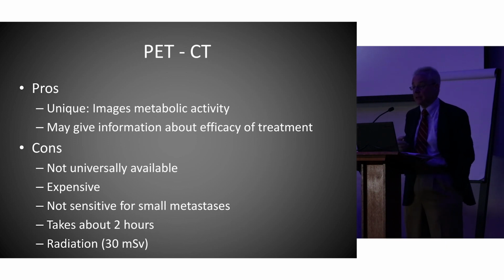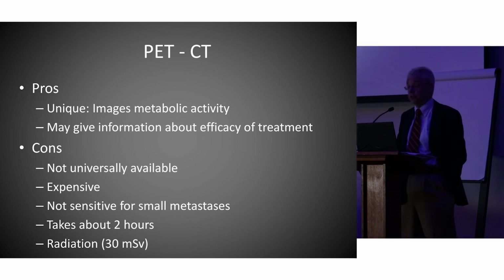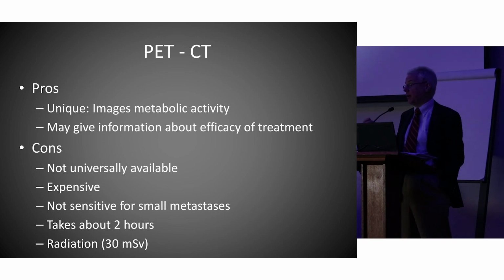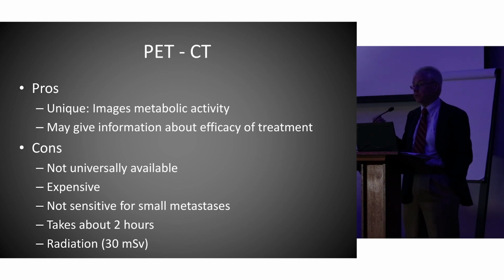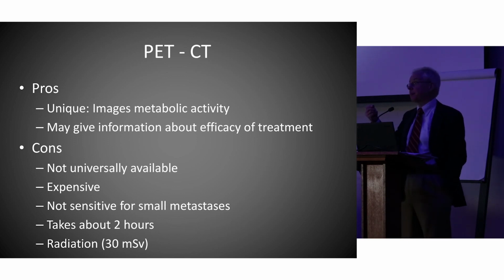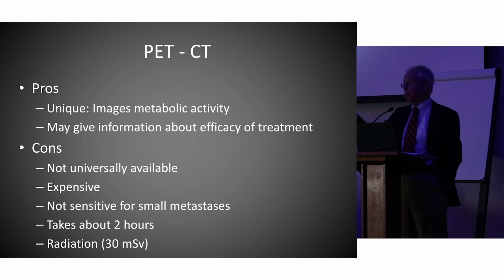It depends on how much glucose it's using up, okay? And so PET scans can be very helpful, particularly in other diseases, to assess efficacy of treatment, because if the tumor is very obvious at one point, they get a therapy, and then it becomes less obvious, that's evidence that, hey, this stuff is working.